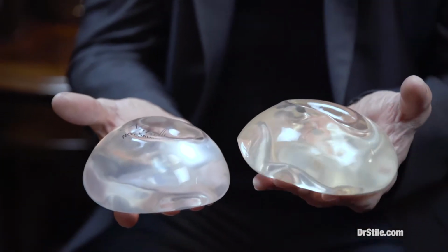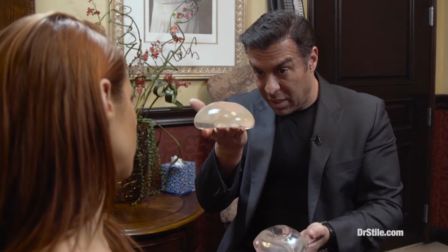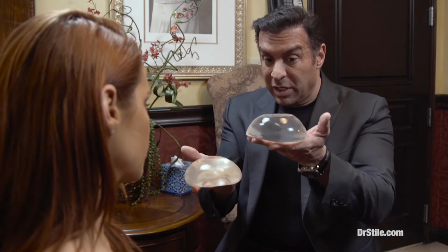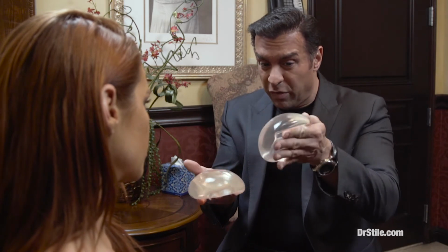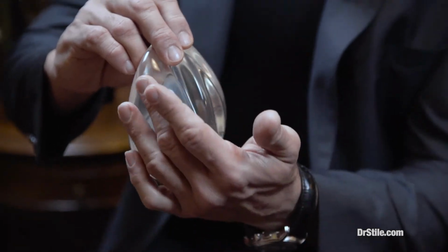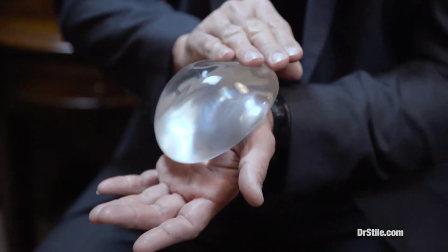I'm just going to show you a quick example. If you look at both of these implants, this is what you have right now: a moderate plus cohesive gel implant, and this is a high profile cohesive gel implant. But this is what you call an overfill. What's really nice about this implant is that when it sits in the pocket, it almost takes on an anatomic implant shape.